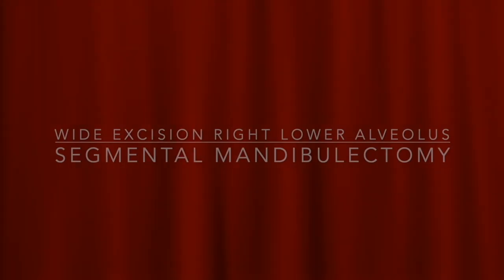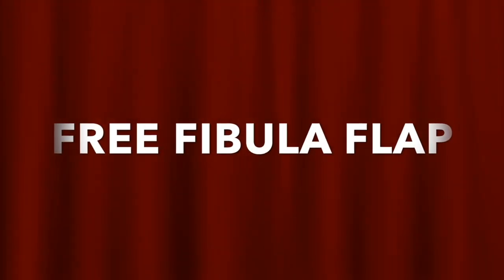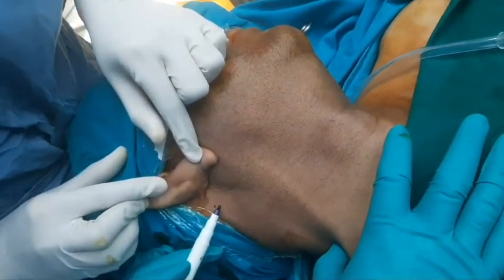So this patient is having disease at right lower alveolus. So we have planned right side robotic neck dissection, wide excision segmental mandibulectomy with free fibula flap. The neck dissection will be supra-omohyoid neck dissection.